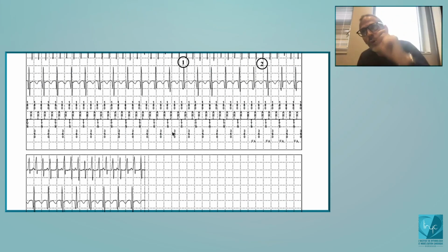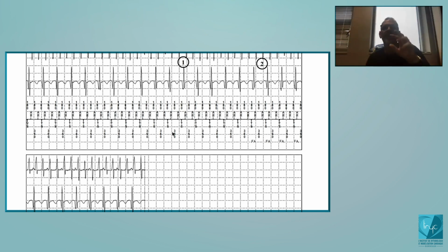If you have programmed both the PR logic and the wavelet, if the diagnosis with the PR logic is SVT, like in this case, there's not going to be any analysis of the wavelets, no correction by the wavelet for a diagnosis for SVT. Okay, so if you program it both, what is the more important is the PR logic, because that's clearly the first step before the analysis of the wavelet.